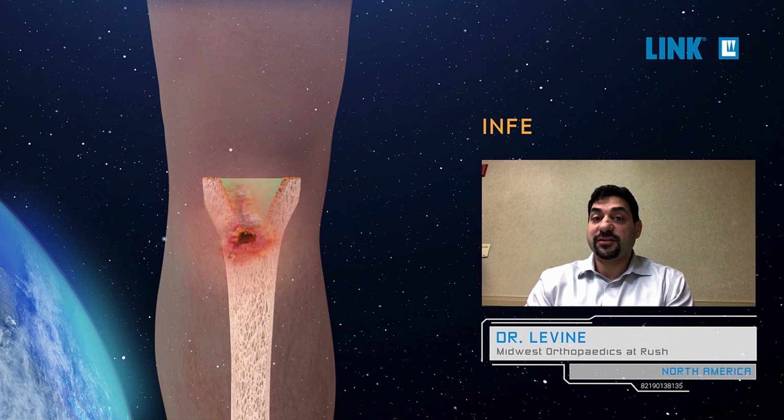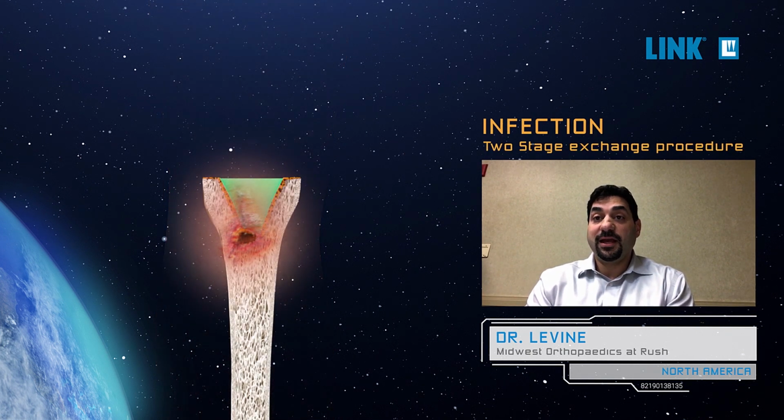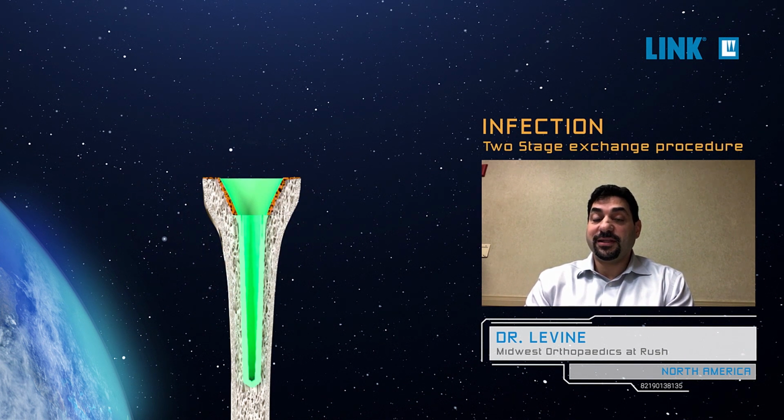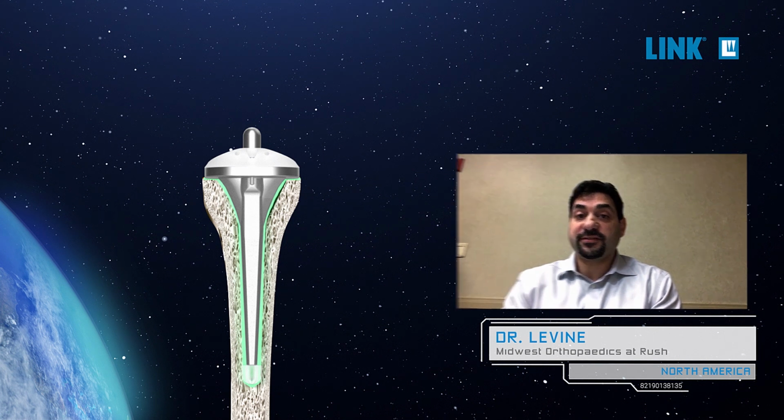When we come back in to reimplant patients, oftentimes there's flexion extension mismatch issues. There's oftentimes problems with the skin, and the ENDO model allows us to adjust the flexion extension gap and treat that independently, as well as occasionally shorten the limb so that we can get the skin closed or improve their ability to flex their knee. Overall, it's been the implant of choice for me for a hinge for the past 5 to 7 years. And most of our fellows that graduate now, it's their hinge of choice when they go into practice.